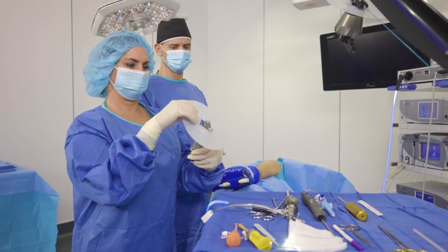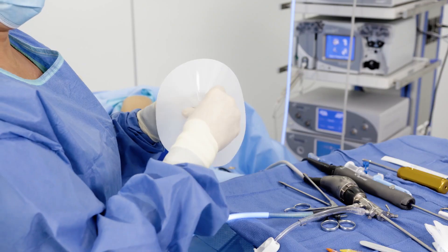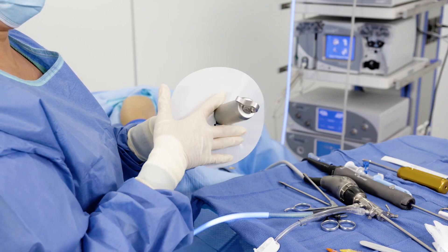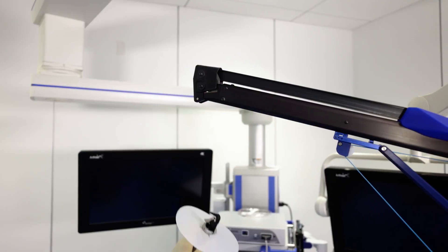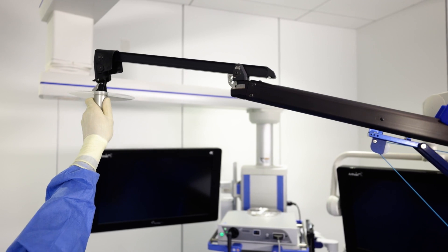Direct lateral distraction for arthroscopic joint visualization is achieved using the autoclavable lateral distraction sling connector with a circular sterile disc barrier. Attach the sling connector to the upper extension boom of the tower.